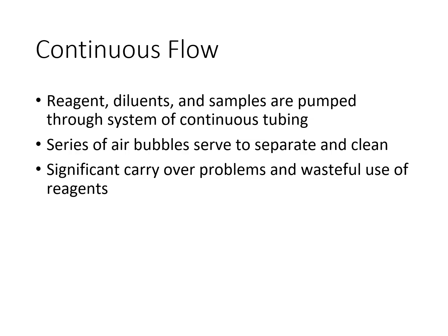The air bubbles help with the carryover, but there is still significant carryover that can occur. Like I mentioned, despite the air bubbles, some reagent or sample from the previous test could contaminate the next, which affects the accuracy. It's also a wasteful use of reagents. Since there's a continuous flow, it means the reagents are flowing even when not being used. That leads to a higher consumption and cost. The tubing and flow path maintenance can also be pretty complex.